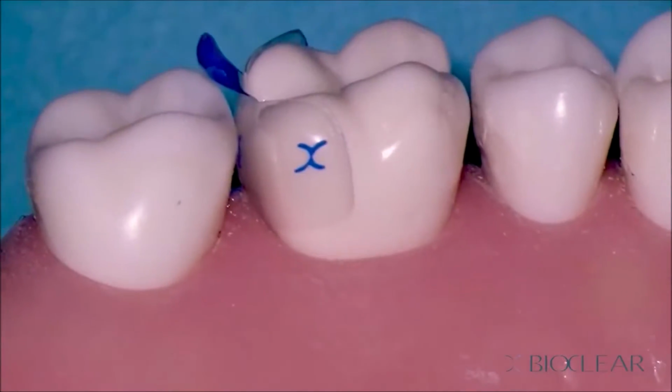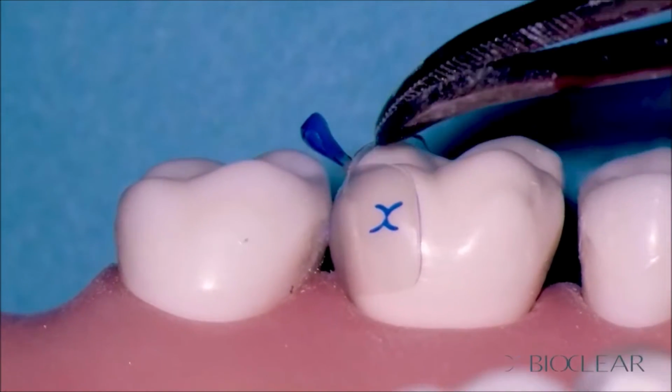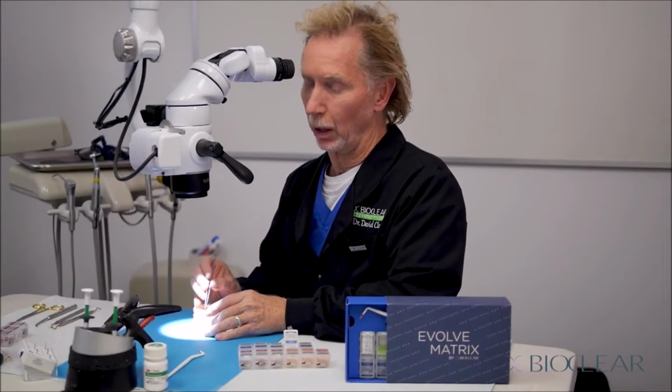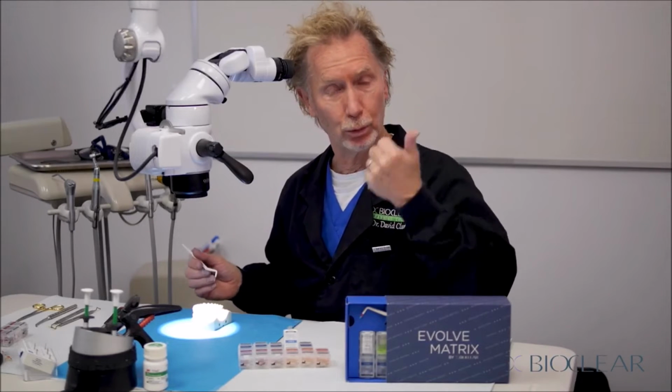You can see the extension going below the gum line. The contact is right where I want it to be. The marginal ridges are going to line up. That's an excellent choice. And the blue Evolve is what I'm going to be using probably about 90% of the time. Let's take a look at the other side of the arch, and I've changed the teeth a little bit to simulate the one time when we don't want to use the blue Evolve. That's with root proximity or very wide, flat teeth.